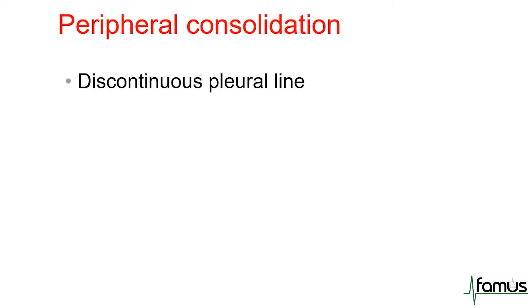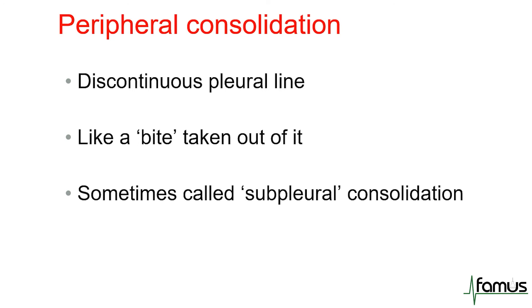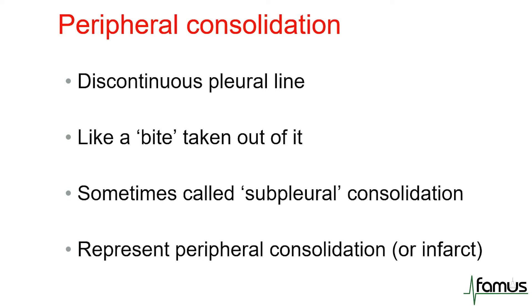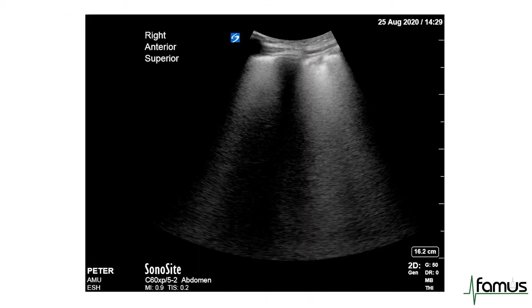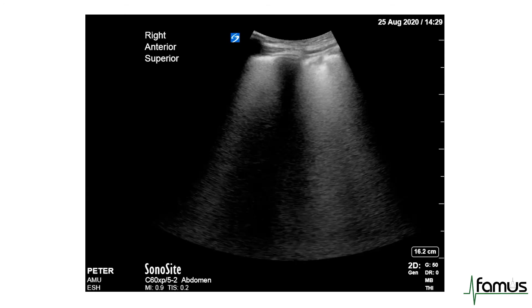The idea of peripheral consolidation is that you get a discontinuity of the pleural line. Normally you'd expect the pleural line to be smooth, flat, and white, but if it becomes thickened or irregular — and in particular if it becomes discontinuous — that suggests a peripheral consolidation. It almost looks like a bite has been taken out of it. It's sometimes called sub-pleural consolidation. In this video, you can see on the top right-hand corner a small area of peripheral consolidation. As we play this cine, you can see that the pleural line in that area is discontinuous — it almost looks like a bite has been taken out of it.